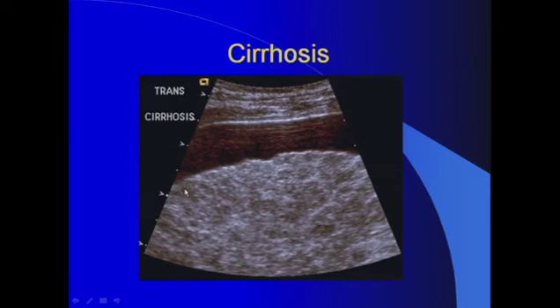Another example of changes that you can identify in cirrhotic patients, in addition to the nodularity of the surface that you can see here at the interface of the ascitic fluid anteriorly, are these multiple hypoechoic lesions scattered through the liver parenchyma. These cannot be adequately characterized by sonography. All you can do is describe them, and most likely they may represent regenerating nodules, but an HCC among any of these could be a possibility, and further imaging with MRI may be helpful to better quantify this nodularity and these nodular lesions in this liver.